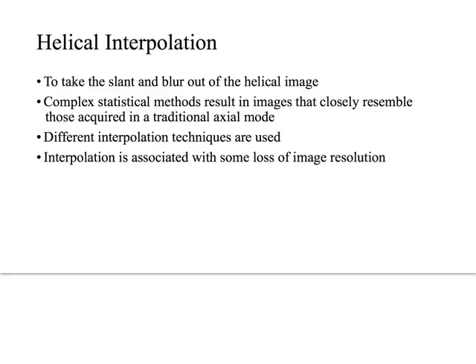One of the main things that I would have y'all take away from this discussion of interpolation is, if you look in the second column, about midway down, it says interpolation methods quickly improved from those first introduced, and this effect is not nearly as pronounced on scanners used today. So the problems that we had with interpolating data are not as bad as they used to be.